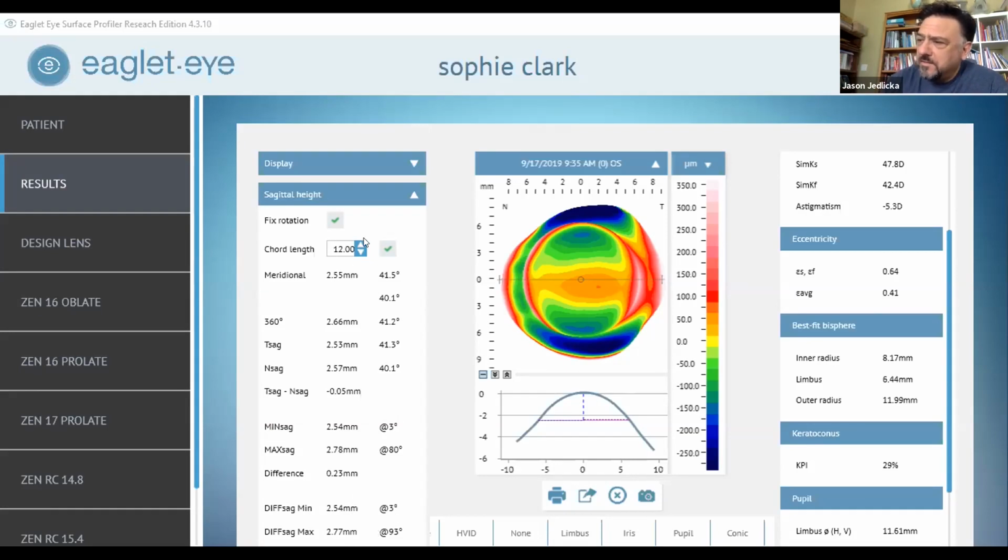Now, if I were to take this up to 17 millimeters, you'd see it's about 430 at the end of the contact. So historically, when we fitted her in lenses, we had to compensate for 430 microns of elevation difference, but we had to do it entirely in the haptic, instead of building it where the toricity difference actually is.